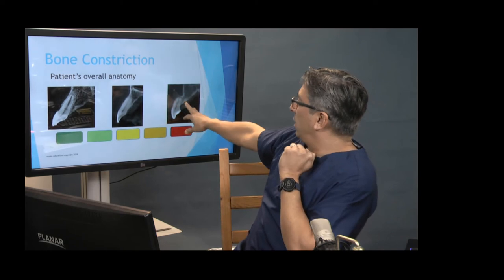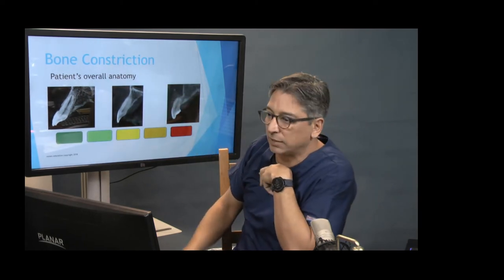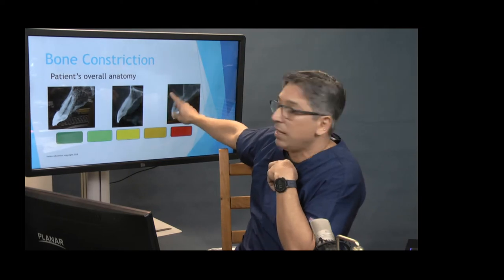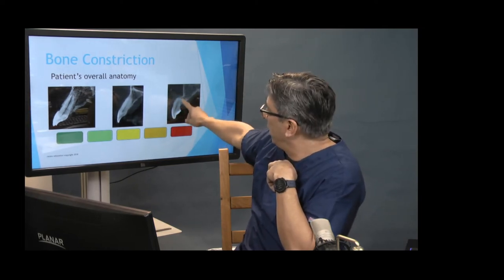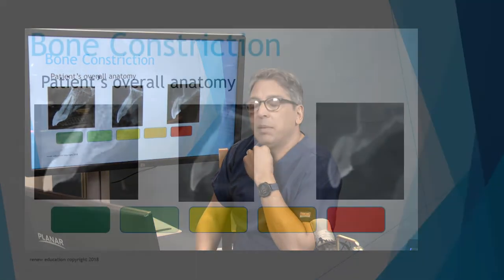And then here's a really difficult one. That's a red. You can't do anything with this case. You cannot graft on the outside. And once this thing is extracted, it goes down to a little nub. It goes down to a little knife edge. And many people don't understand that.